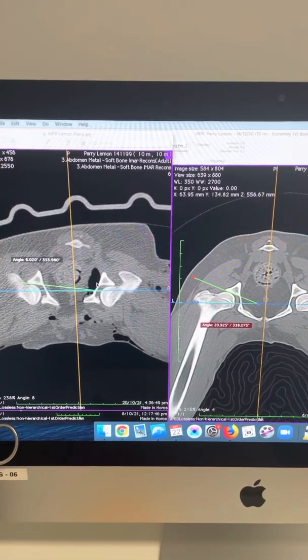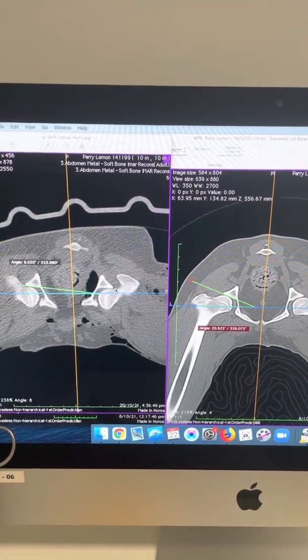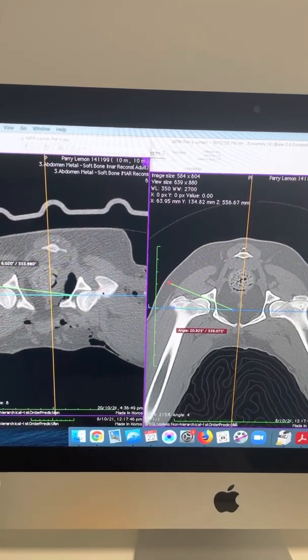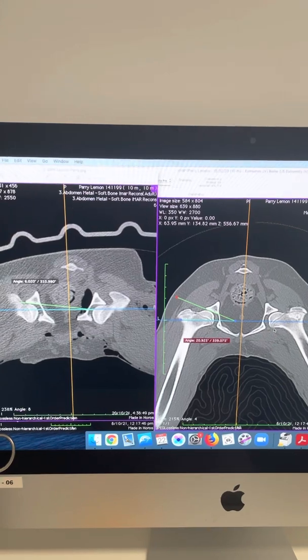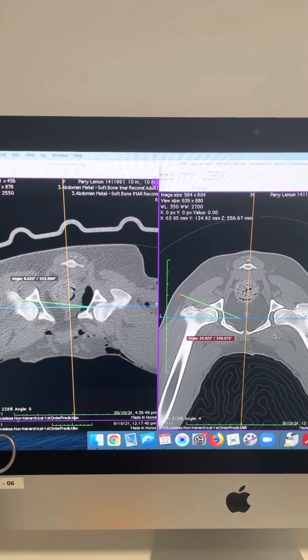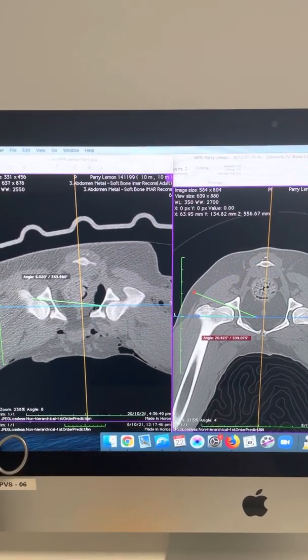We actually did a bilateral procedure on this dog, and on the other hip we can see that angle is much closer to zero. You can see the effect between the post-op images on the left of the screen and the pre-op images on the right — changing that morphology, tipping that acetabular rim over, actually gives us better ability to capture the femoral head and make these dogs a lot more stable.